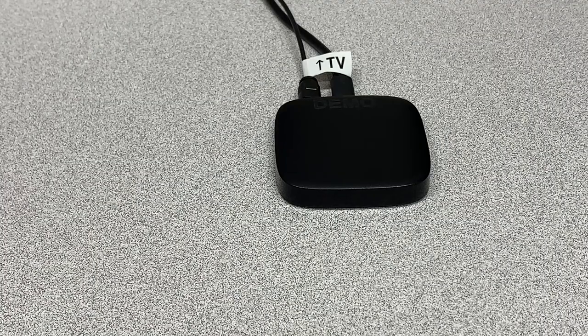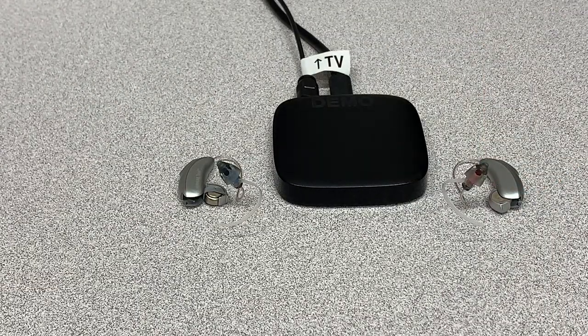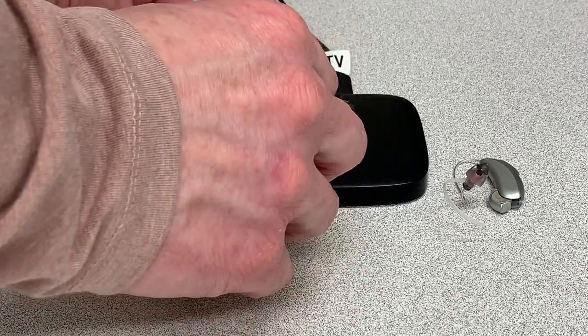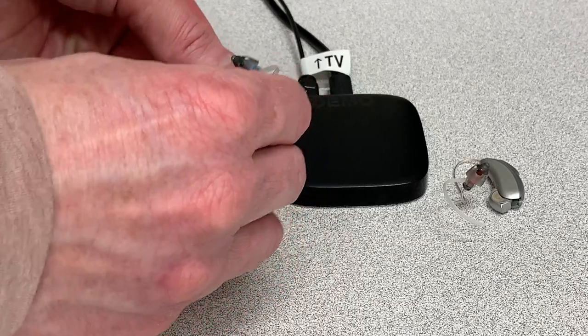To connect to the compatible pair of Phonak Marvel hearing aids, we start with the hearing aids in the off position — battery doors are open. If you can have the devices in your ears and then power them on by closing the battery doors, you will get an audible indicator when you have a successful connection with the TV connector. In this case, we'll just turn the hearing aids on by closing the battery doors.